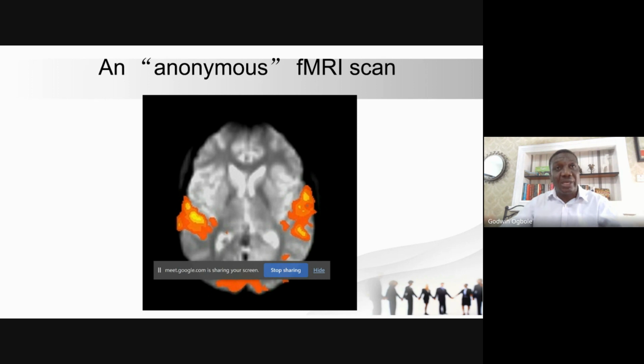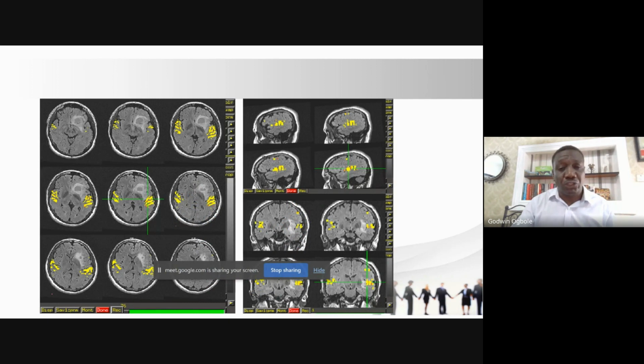And when oxygen flows into that area, the computer is able to show that there's a signal in that area. So when somebody is lifting their hand or leg, you can say, this is the part of the brain that is functioning. This gives you a pattern of the brain in a particular tumor, to see how the function of the brain can be affected by tumors.